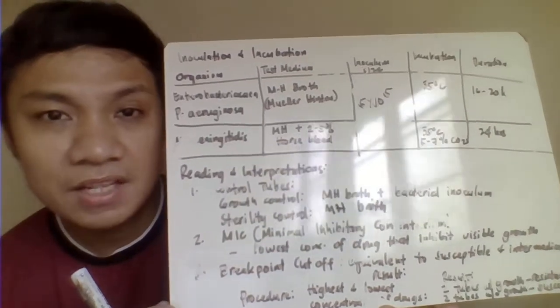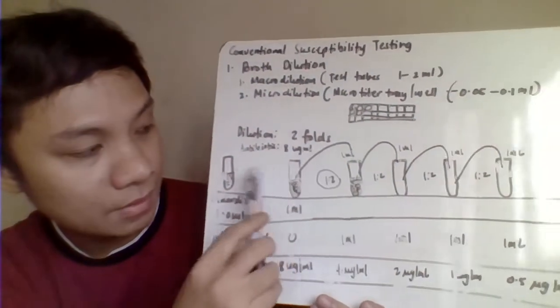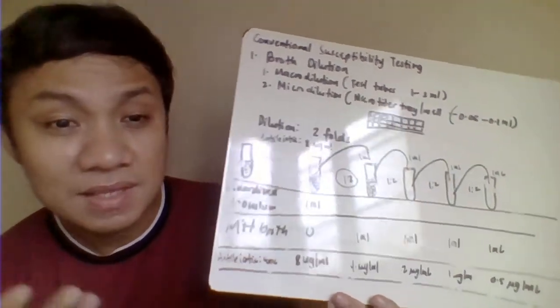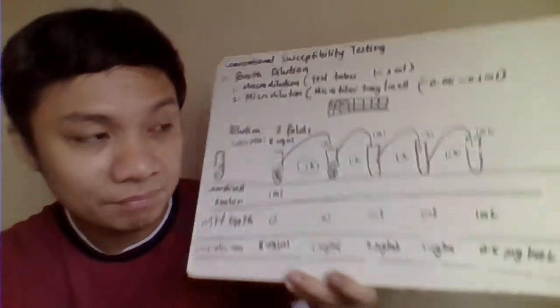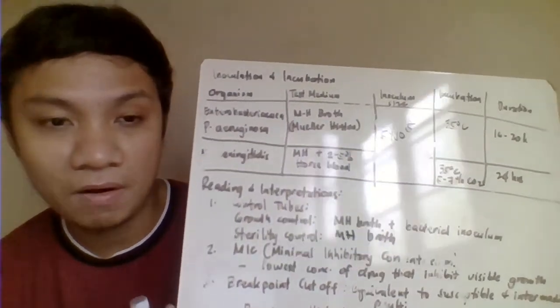Another disadvantage of your broth dilution here is that pag isang set up, isang antibiotic lang ito. Okay, so pag madami, kung gusto mo i-test ang different antibiotic, madami kang test tube na gagamitin. Okay, so those are the disadvantages of your broth dilution.